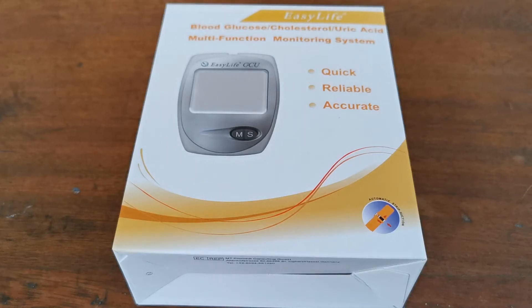Welcome to this Valium Ed presentation where we're going to run you through what comes in an EasyLife triple meter. This one is the glucose, cholesterol, and uric acid multifunction monitoring system. That means you have the ability to test with individual test strips for blood sugar, blood cholesterol — that's total cholesterol — and blood uric acid. So let's open up this box and show you what's included and what you'll get.